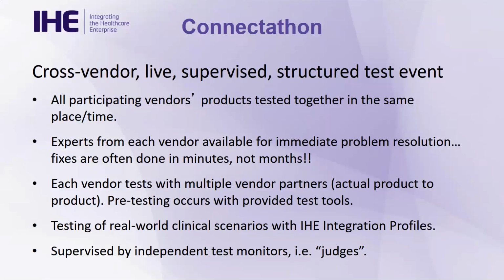And I do want to mention, if you do join IHE-RO, there are test tools that are available that you can do testing throughout the year against IHE-RO test tools. It's real-world clinical scenarios, and it's supervised by, I say independent test monitors. By that I mean the judges who sit down and look at this and look at the transactions are not from any company.